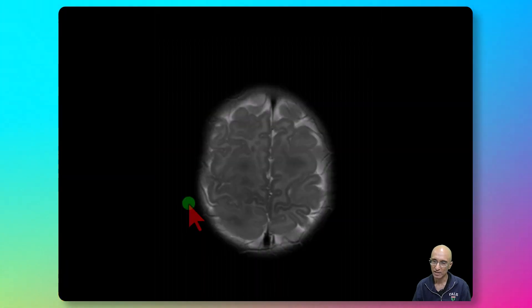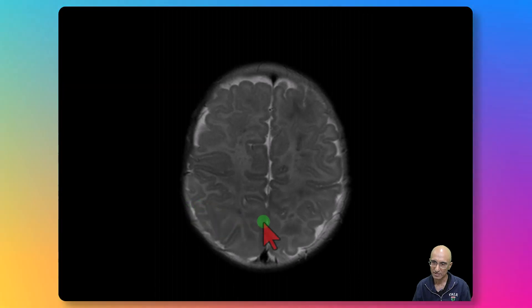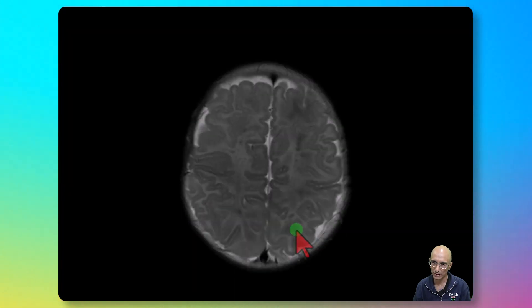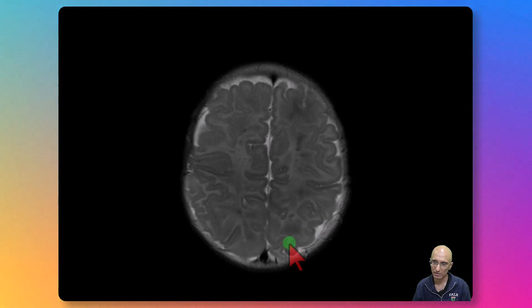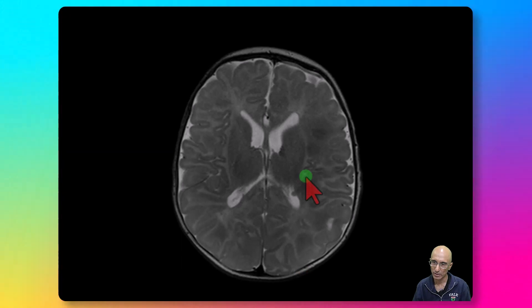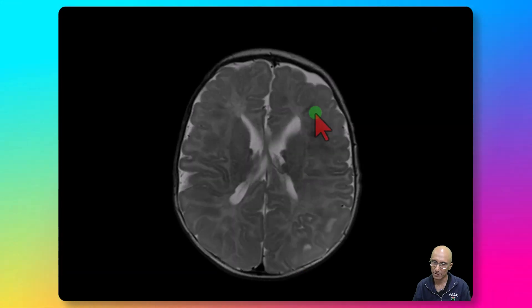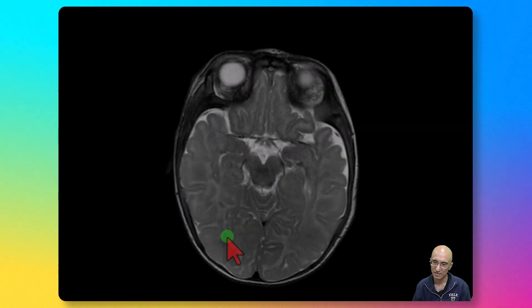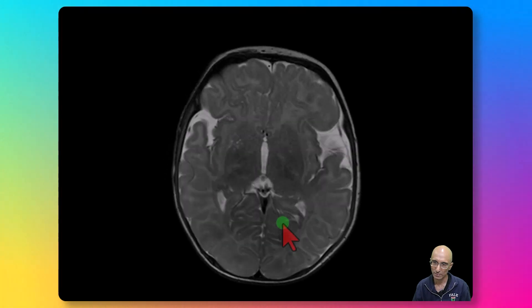On the T2 sequences, we can see similar findings. These lesions are T2 hypointense. We can see T2 hypointense lesions in the sub-cortical regions, sub-ependymal T2 hypointense lesions, and radial T2 hypointense bands extending from the sub-ependymal region to the cortex, along with multiple additional T2 hypointense lesions in the white matter.